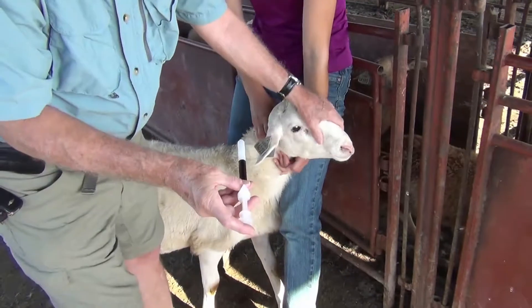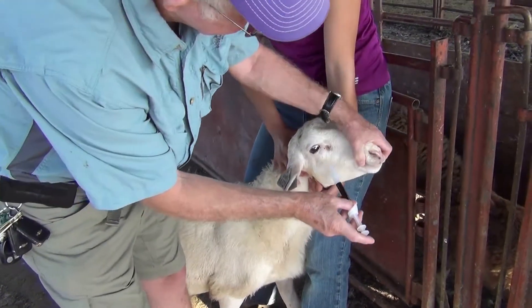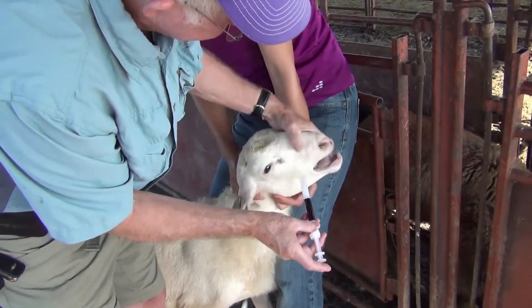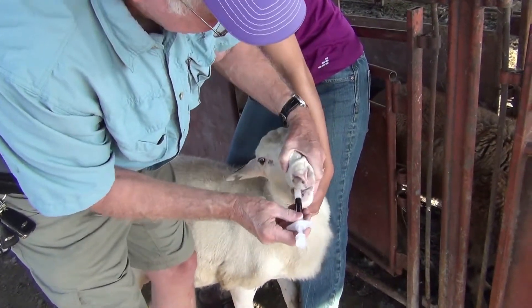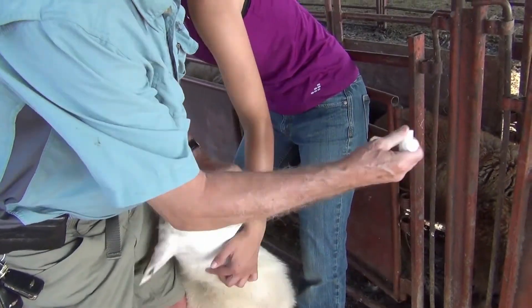You want to make sure the bolus hopefully gets over the back of the tongue so it'll slide down easy. I split my fingers in between — don't pull it off the nose. I try to get the pill gun all the way to the back, over the back of the tongue, and then deposit the pill and pull it out.